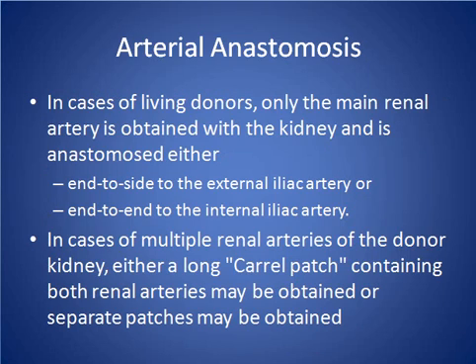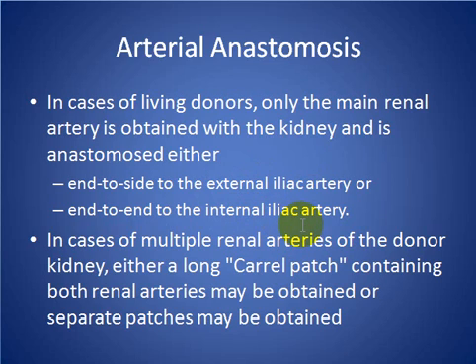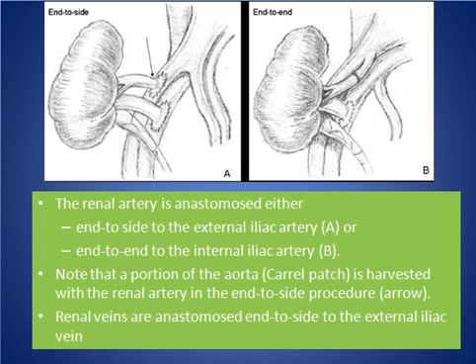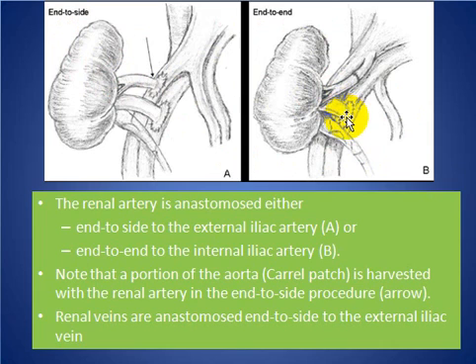In cases of living donors, only the renal artery is obtained with the kidney, and it is anastomosed either end-to-side to the external iliac artery or end-to-end to the internal iliac artery. As seen in this image, this is the end-to-side anastomosis and this is the end-to-end anastomosis.